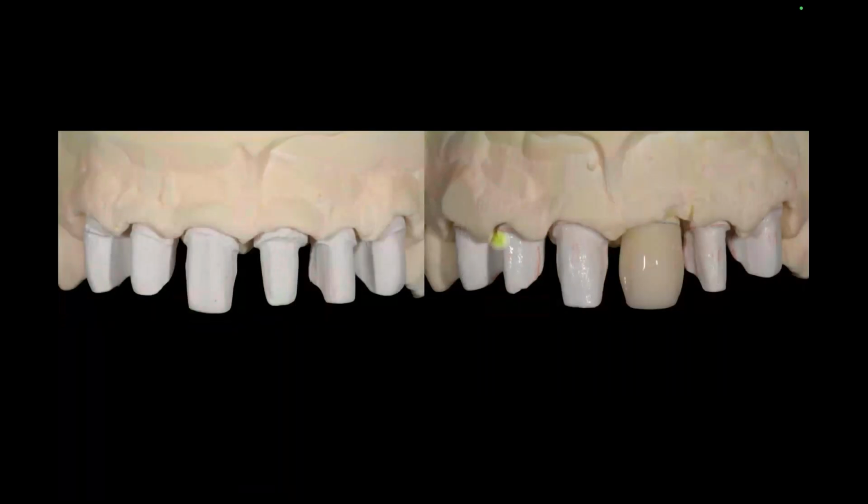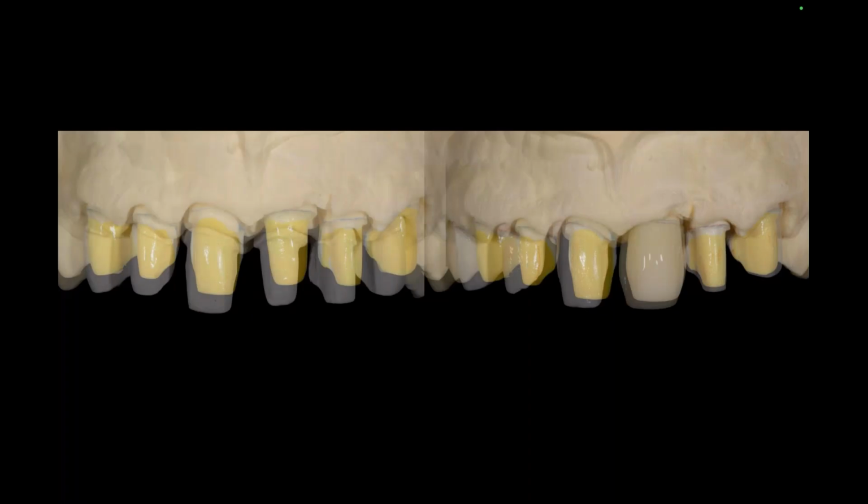So I spent most of my time building up this little core with opacious materials, adding fluorescence in them. And the goal was, I didn't put all the slides in, but I actually painted this die black, and I put some glazing medium in here to put this on so I could see if I really masked out those dark colors, right? And in the end, it got pretty close to what I wanted it to be.